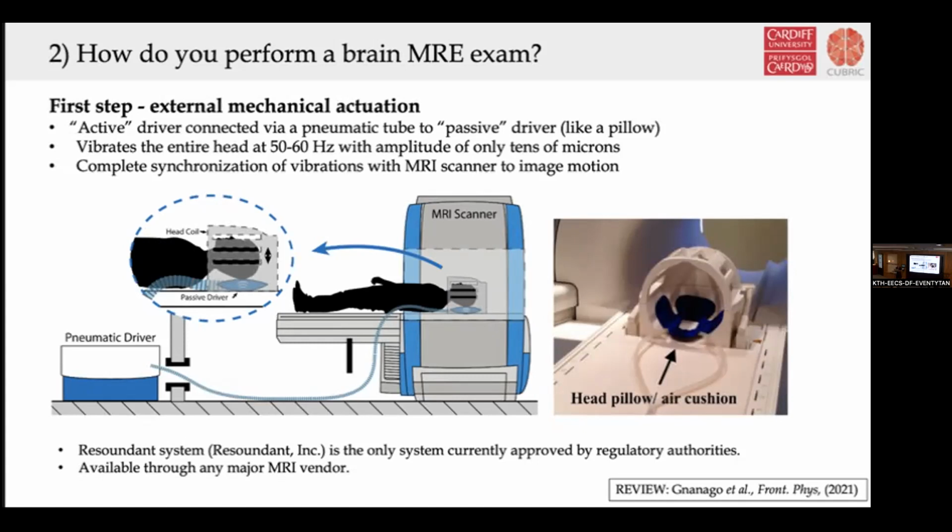Throughout the history of MRE, people have developed their own actuators. There's a review there which discusses the pros and cons of each type of actuator design. But the pneumatic device developed by a company called Resoundant, shown in this image, is the only one currently approved by regulatory authorities.